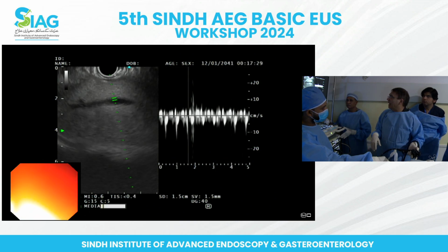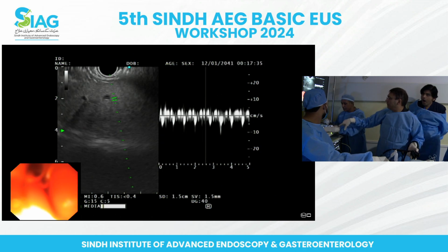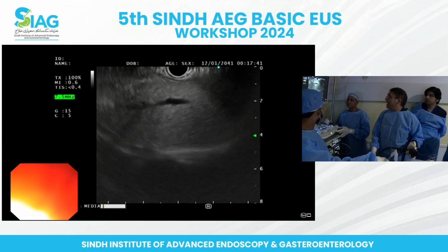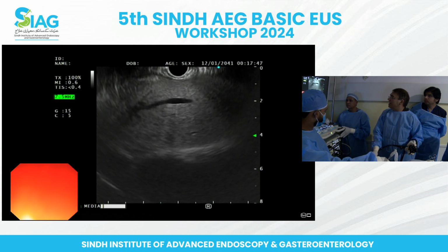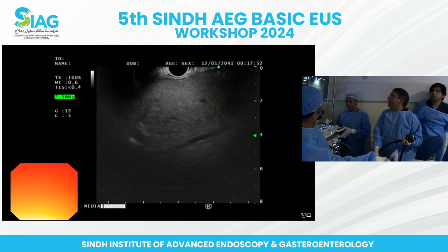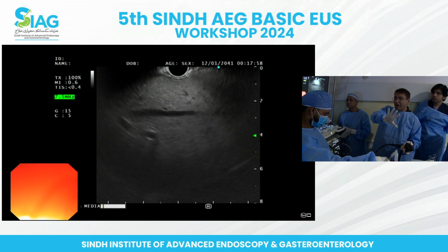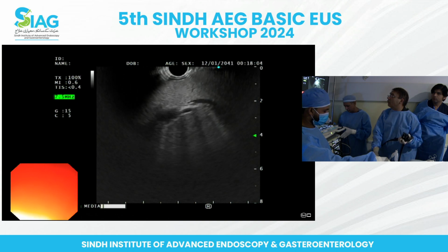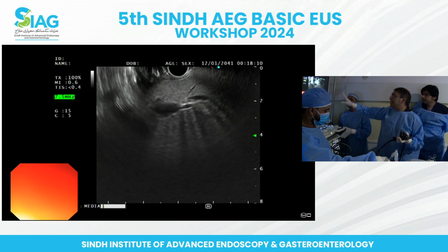So here, take it back again. Okay, here you see segment 2 above that left hepatic vein, segment 3 below that. If I bring the scope back just a very little and start rotating to the right, I don't see that. Keep in mind this is a big liver, by the way, so it's not giving that much penetration. But I pulled the scope back a little bit and started rotating to the right. When I did that, I come to this big vessel right there in the center.